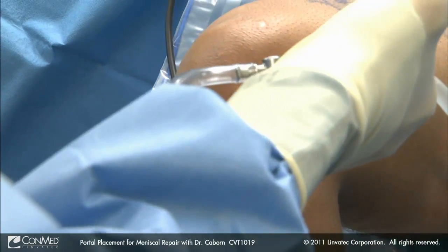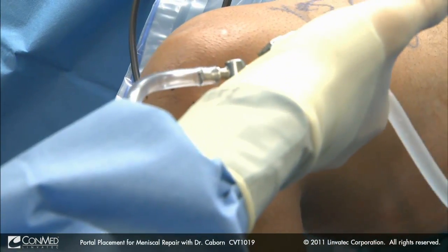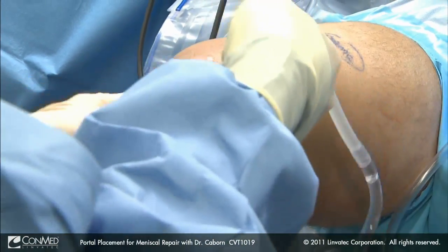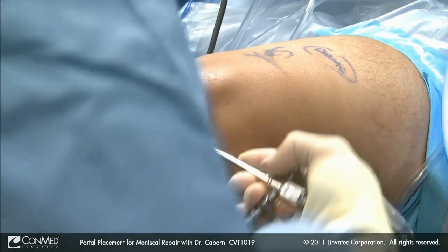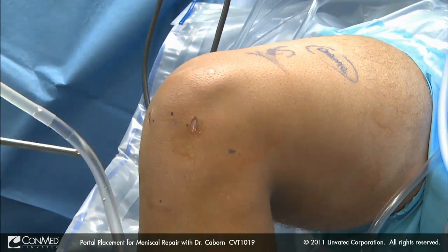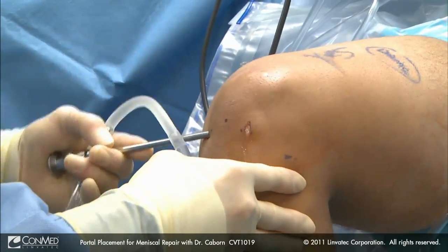We introduce our cannula. We should be coming at this angle down — we should not be going flat. If we're flat, then we have too low a portal placement. We come across the front of the notch and release off our ligamentum and any scar around that stump of the ACL. Likewise, we come across and release this.